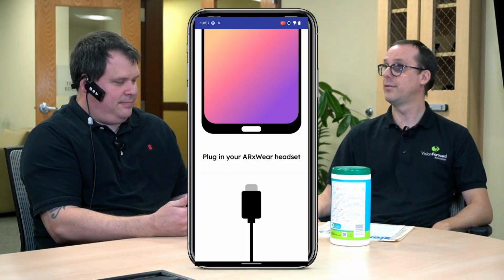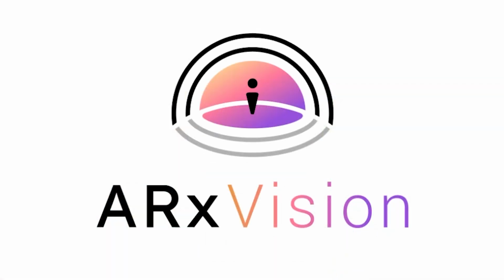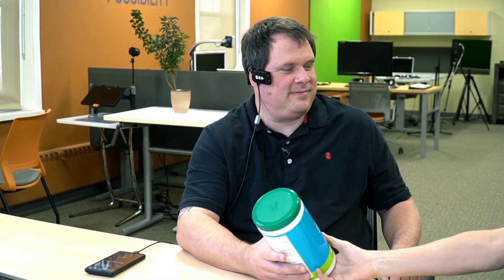Cool design, it should automatically start the program. Get ready for this now. Boom. All right, I have to say, I do enjoy that. If you're not ready to use this app, I don't know what is. All right, so short text you said, right? I'm gonna use the mode button, the triangle farthest away from my face, and let's switch modes. Short text. All right, so we're in the mode. Let me pass you the product here. All right, so I'm gonna take it, look at it.